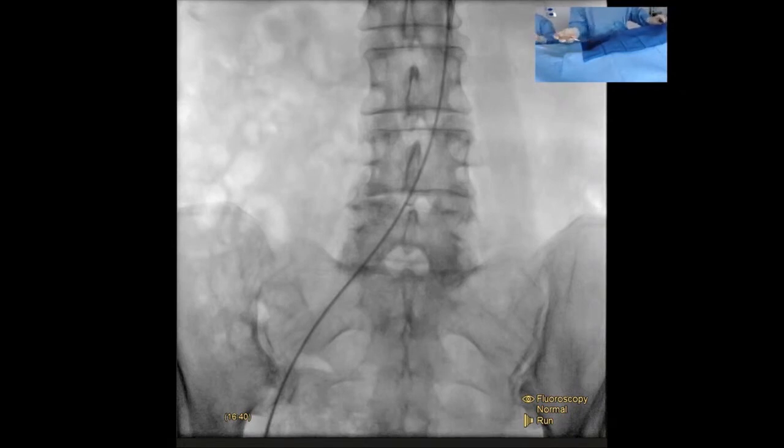Yeah. So to come in as a patient and to have a case like this, where all you're doing is a single puncture in your groin area, and all you're feeling really is the lidocaine shot. And then to have your hemorrhoids treated 40 minutes later without feeling the pain during the procedure. Really remarkable. Yeah, it's really unbelievable. So I think this procedure has really come a long way, and offering it with such high success rates, published now over 90% consistently, compared with other therapies like banding with success rates that are probably 20% lower, or may require multiple treatments. It definitely has become very desirable for our patients.